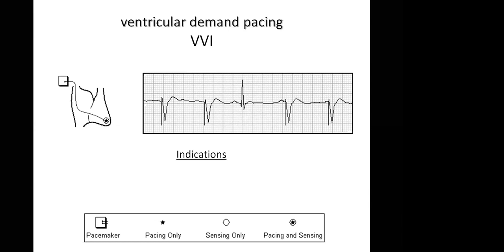Okay, let me skip and come back to the first. The chamber paced is the ventricle, and then chamber sensed. The chamber sensed is, okay, so there's a prolonged PR after the first paced QRS. Oh, I've missed it up. No, I don't want you to tell us which chamber. The first alphabet is chamber paced, the second alphabet should be chamber sensed, right? Yes. So which chamber is sensed?